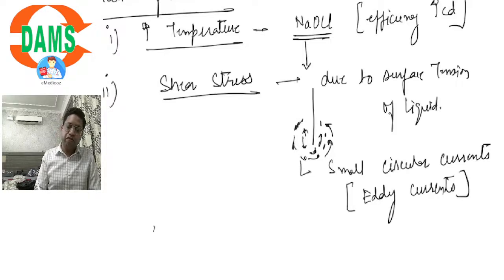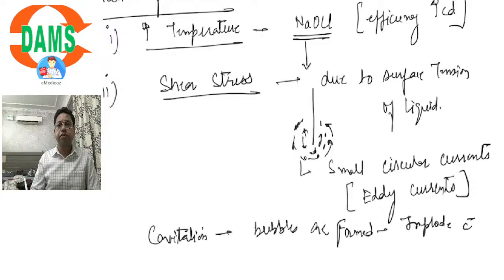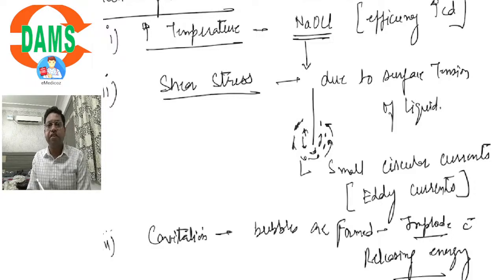There is also formation of cavitation. Cavitation means bubbles are formed that implode, releasing energy. So these are the mechanisms through which ultrasonic systems act inside the root canals.